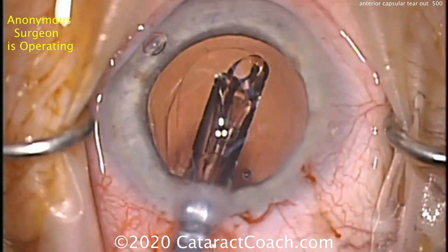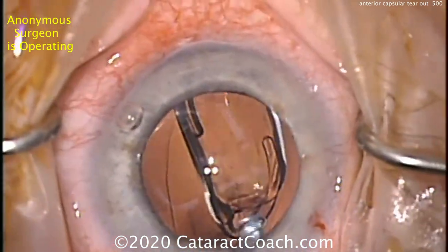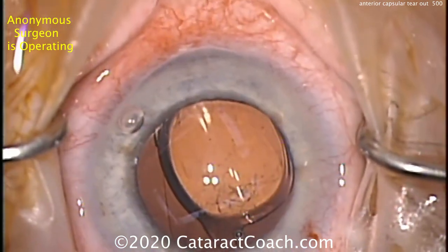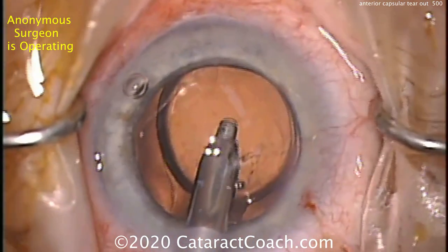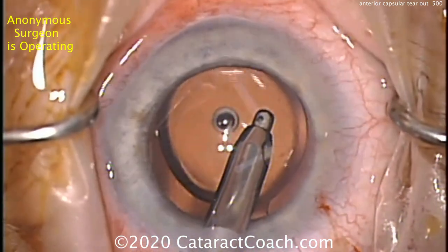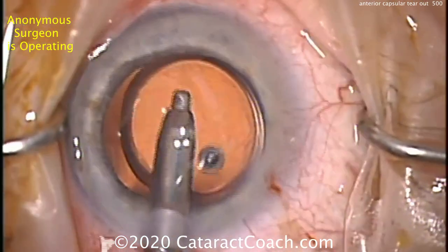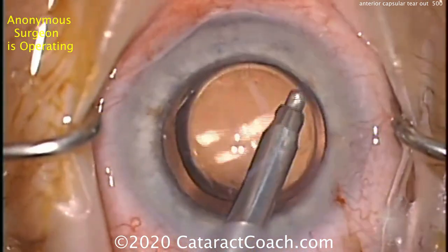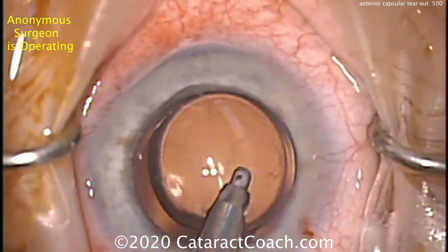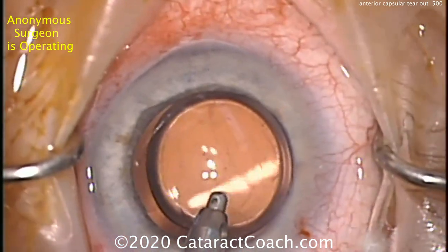So now with the eye filled with viscoelastic, let's get the lens in the eye. What are the options? You can put a single-piece lens in the bag — this will be fine. In this case, I'd try to orient the haptics 90 degrees away from that area. You could put a sulcus lens and do an optic capture and have a pretty good result as well. You could put a three-piece lens in the capsule bag as well — any of these are reasonable approaches. Now removing viscoelastic, being very gentle. I would not be aggressive — I may not even go behind the optic at all. We'll remove enough viscoelastic to have a good result.